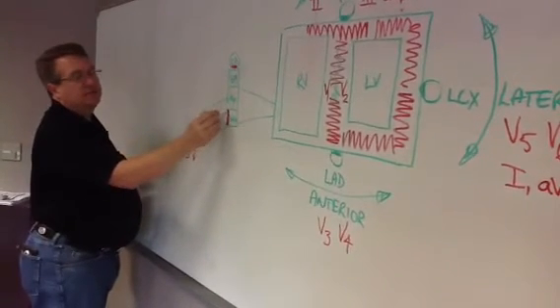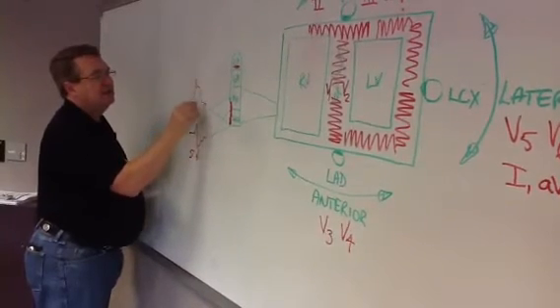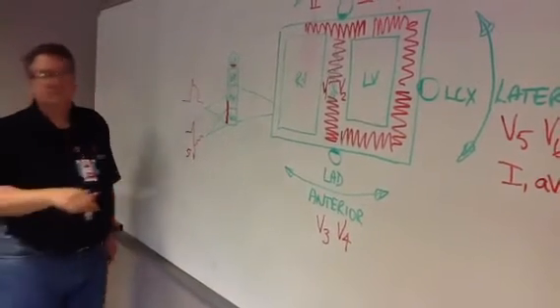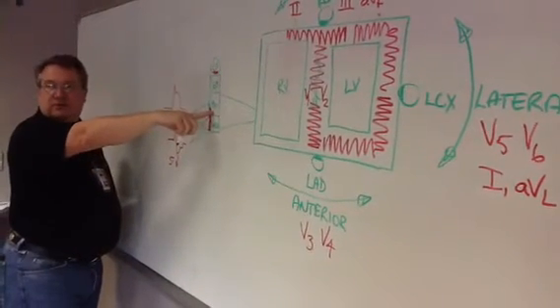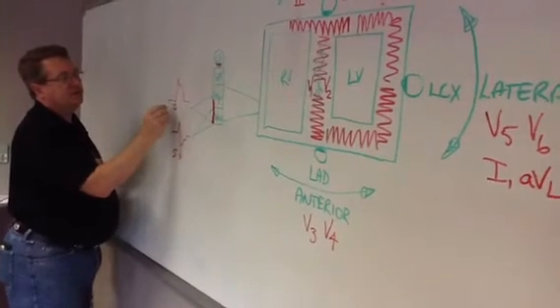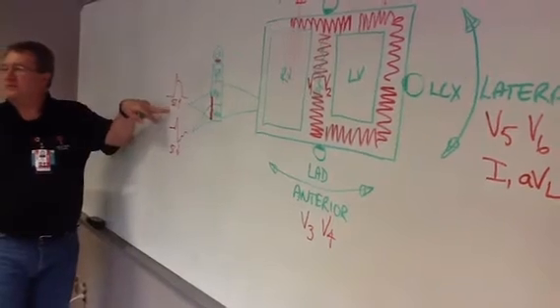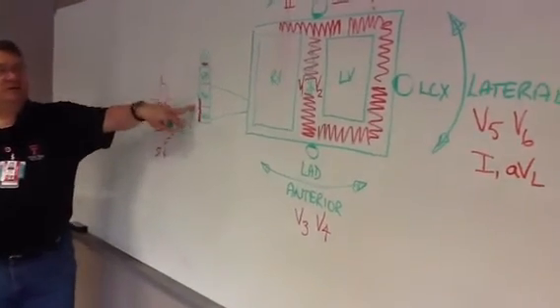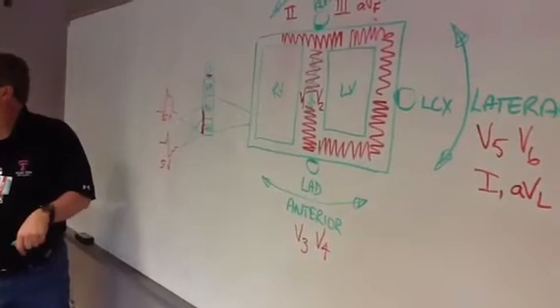As the endocardium continues to die and it moves into the myocardium, that's when you're going to start to see ST elevation. So we go from death of the endocardium to death of the myocardium starting to occur. When death of the myocardium starts to occur, you get ST elevation. So this is your STEMI. So by the time you see a STEMI occurring, you're already looking at endocardial death and you're looking at myocardial death beginning at that point.